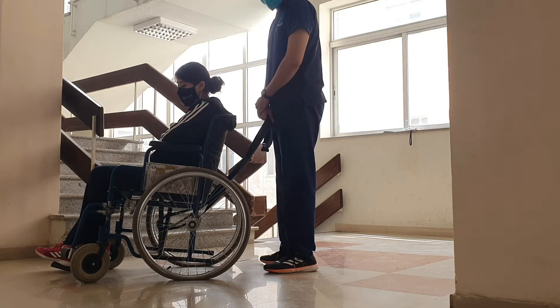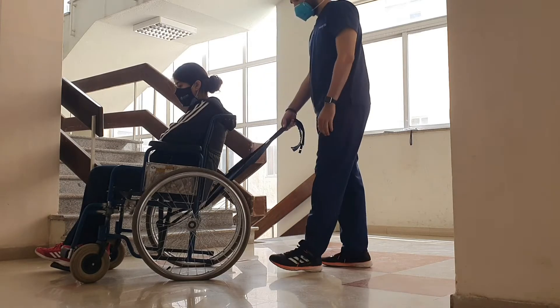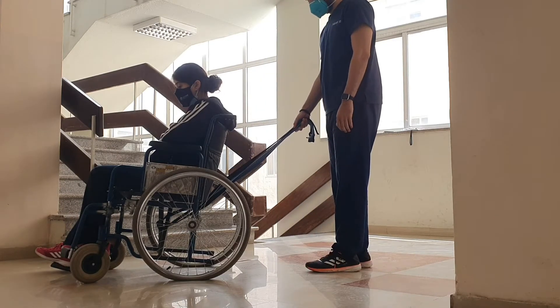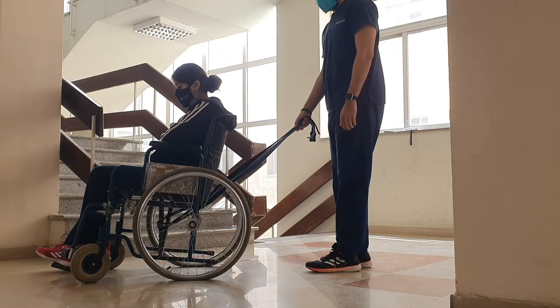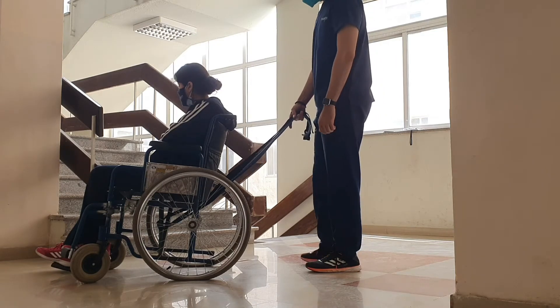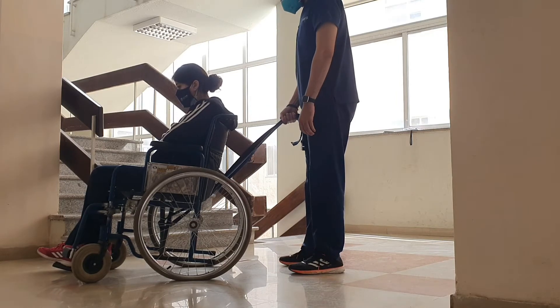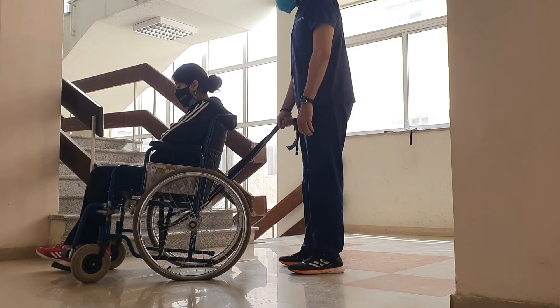A very important thing to demonstrate here is the role of the therapist. There is a rope tied around the frame of the wheelchair, and the therapist holds onto this rope. If the person loses balance, the therapist can pull on it to straighten them up and prevent a fall.